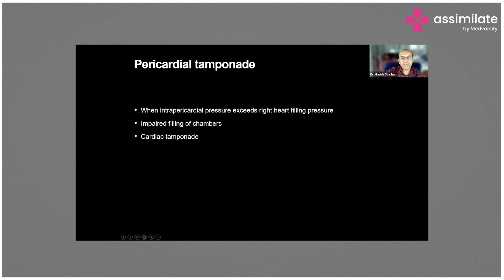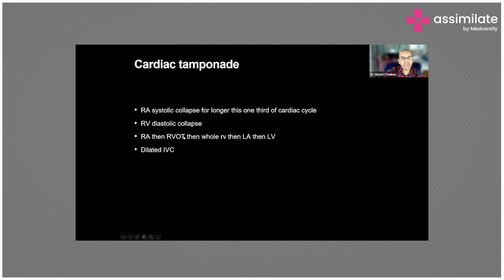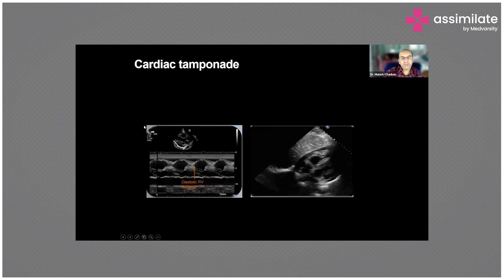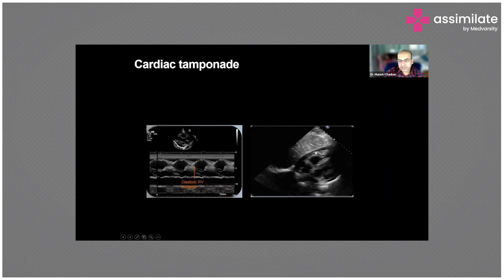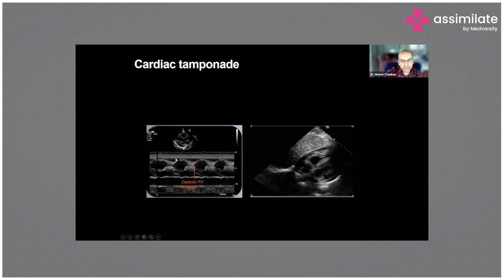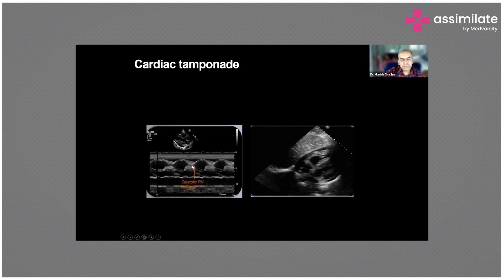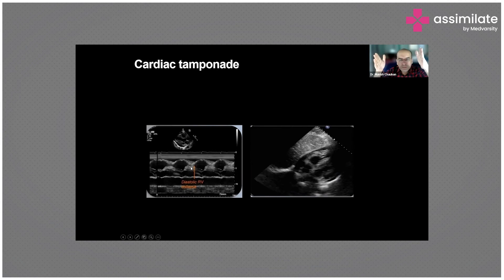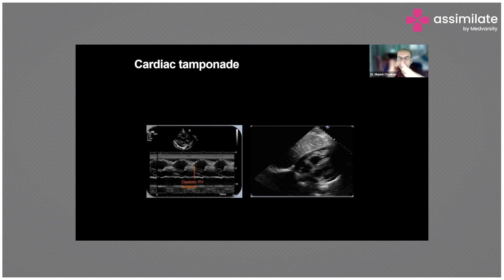Pericardial tamponade - you can see fluid around the chambers pressing the RA down. Earlier when I showed you the image there was no fluid in this area, but now you can see fluid around the RV. The RV in diastole is totally collapsing because of this external pressure. During diastole when it should expand, it is collapsing.